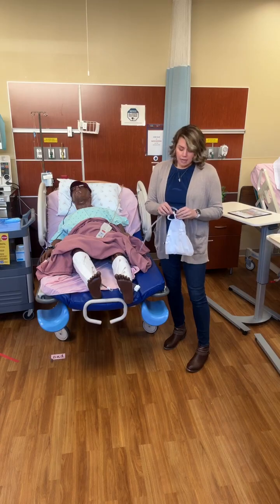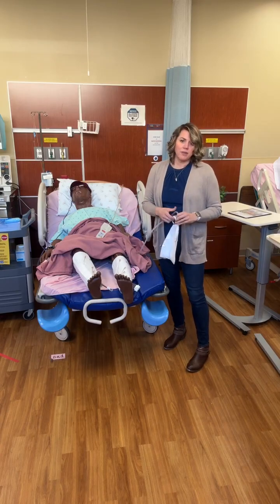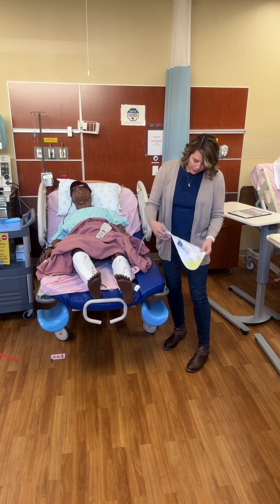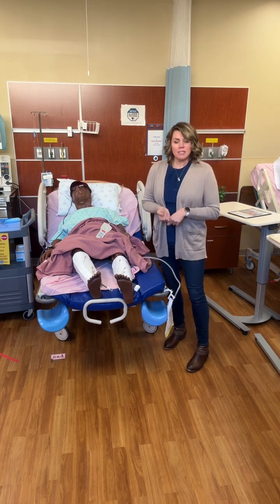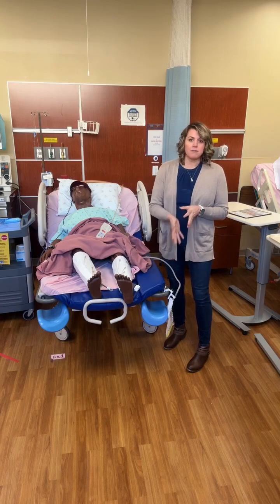I want you to go through the motions of how you would assess if this Foley catheter is in place and functioning as it should be. Then you'll just set it here. If you would want to empty the catheter or the bag, you can verbalize that as well. We'll just leave the liquid in there for future groups.